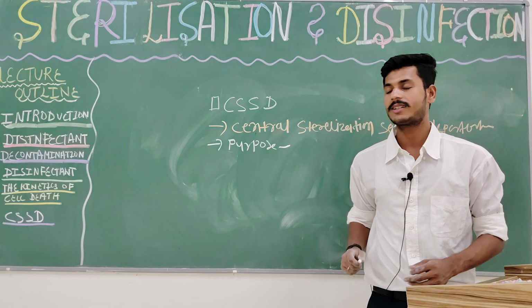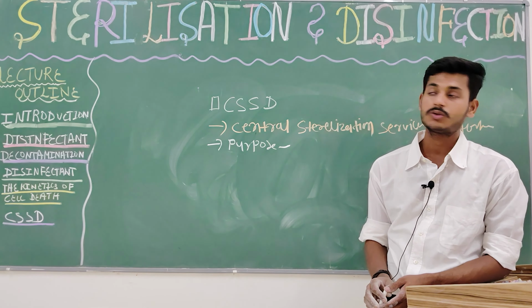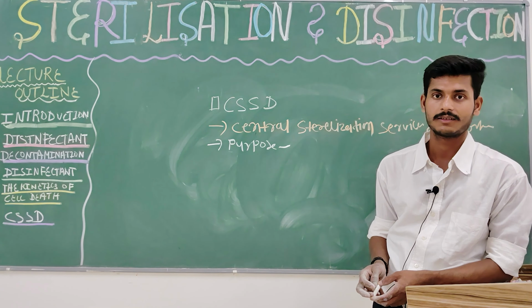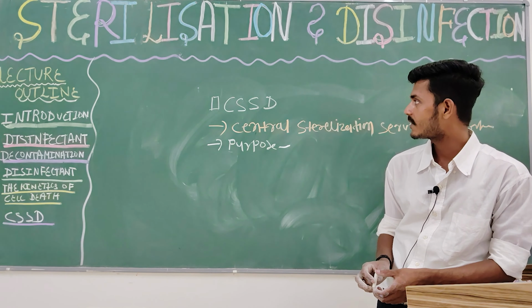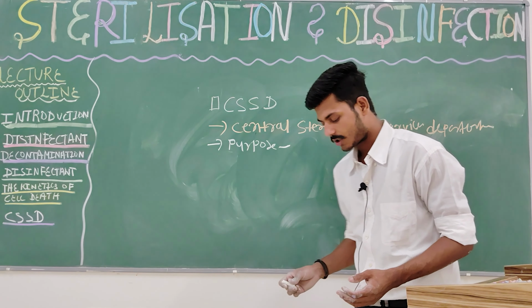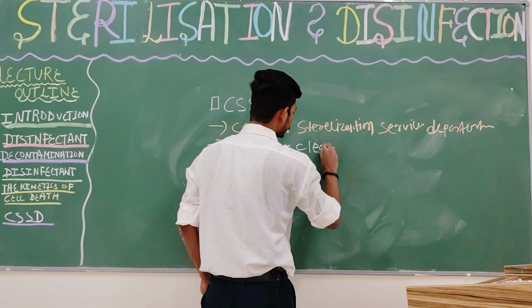Sterility is maintained by this department. This department is also responsible for cleaning of the medical equipment, as well as the distribution.